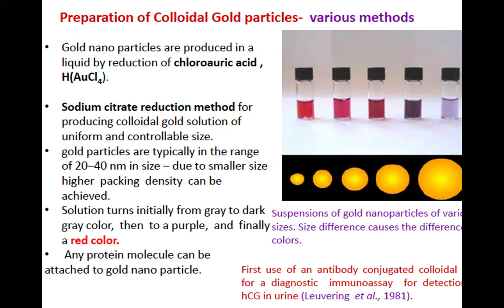And every time you want to prepare the lateral flow, you need to check the stability of the gold nanoparticle solution. Every time you have to check whether they are still stable or they are already aggregated. That's why you need to prepare in small stock so that you will not waste the gold solution.